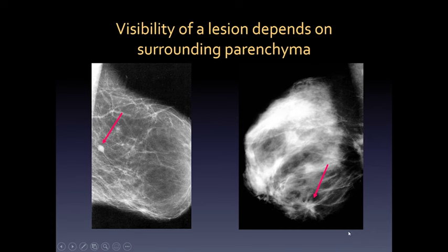The visibility of a lesion really does depend on the surrounding parenchyma. In a woman with a fatty-replaced breast, as in this patient on the left, you can see very easily a very small cancer, whereas in a patient with more dense breast tissue, it is more difficult to appreciate the cancer, although it is detected here with a spiculated breast lesion.